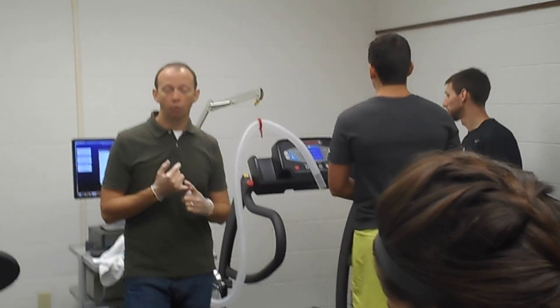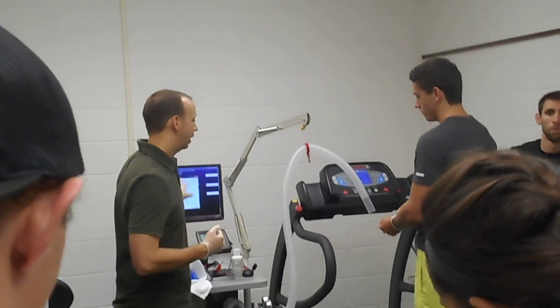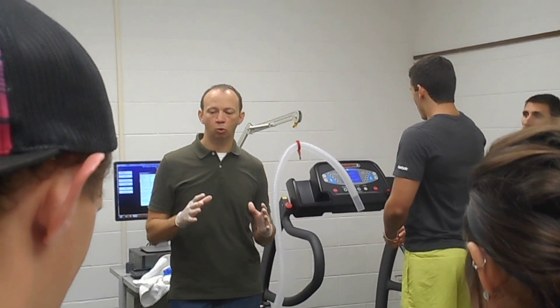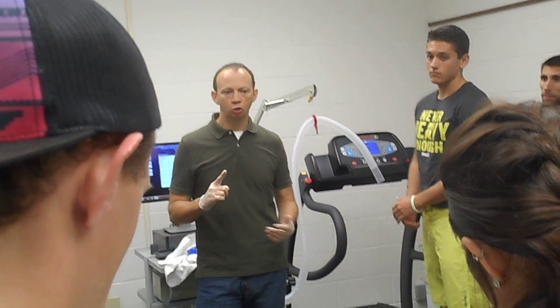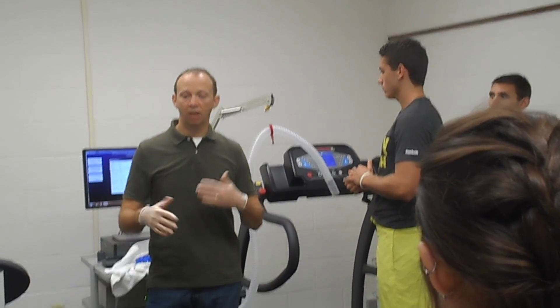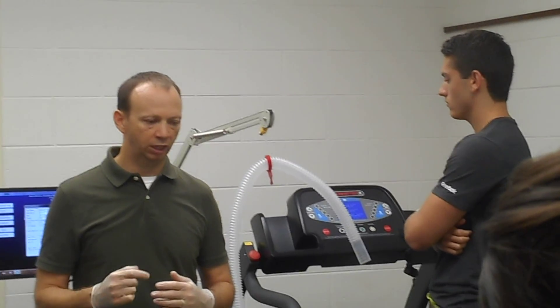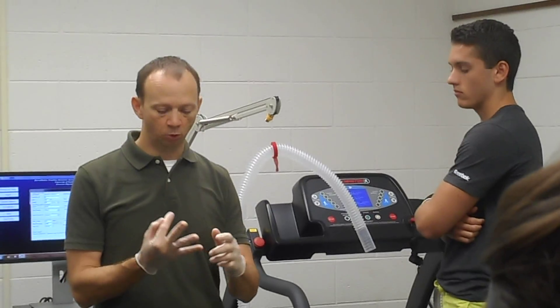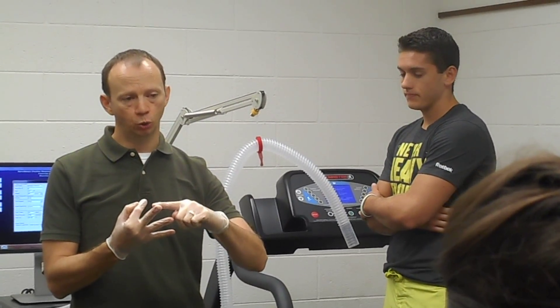Along the way we're going to be assessing a few variables: heart rate, RPE (rate of perceived exertion), and the respiratory exchange ratio — displayed here as respiratory quotient — and his VO2. One indicator commonly used that we won't be using for this demonstration is lactate levels. Lactate tends to rise with exercise, but that's one variable we will not keep track of today. On your sheet it asks whether this was a true VO2 max test — we can look at those three variables: heart rate, RPE, and RER/RQ.